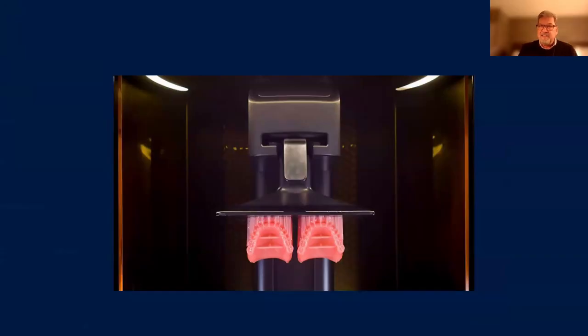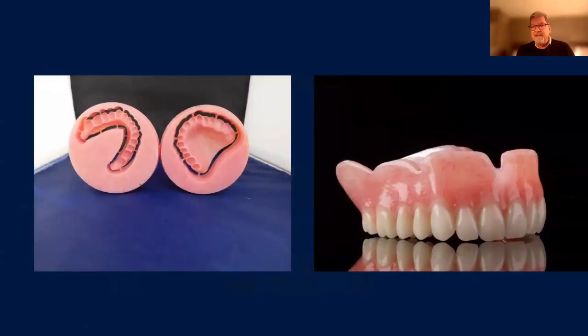With printed technology, if you asked me maybe 5 or 6 years ago, I wasn't a big fan. The materials weren't as good as they are now. It's evolving so quickly, but we still need to know the science and the basics behind what we're doing with dentures. So this particular denture here, I made this 6 years ago.